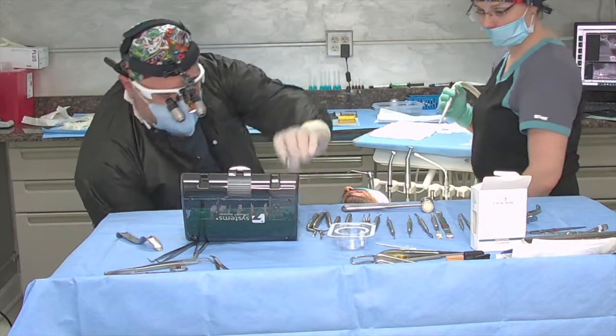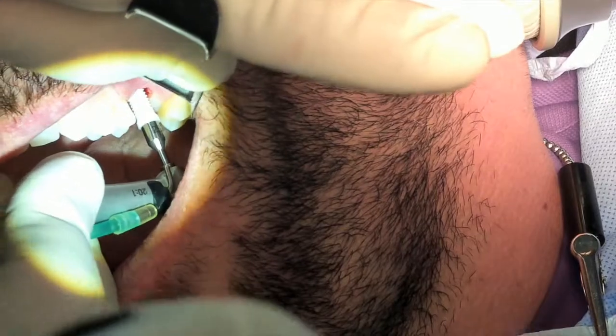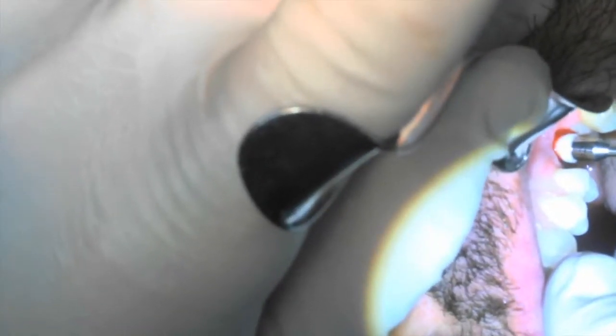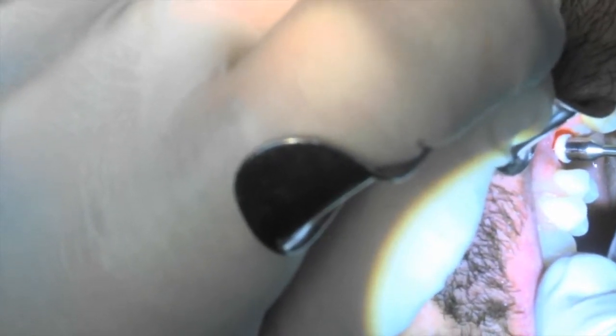So let's go with our Minnesota retractor again. Okay, Matt, let's open for me. Perfect. So the implant's seating. Suction for me. Good. All right, so implant seating. You're doing good, Matt? Mm-hmm. Implant seating, yep. Perfect. So we're at 45 newton centimeters, okay?